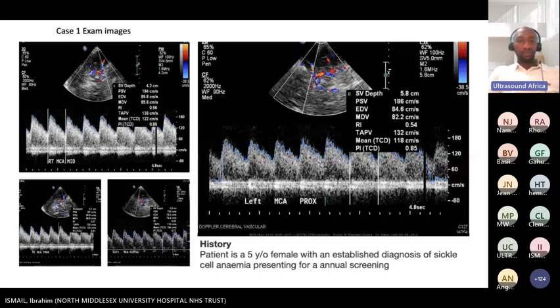Which one do you take? No, you use the highest average mean, the highest one. So you go for the worst case scenario. Yeah, you have to use the highest one. You don't average the average already. So you have to take the highest average that's coming out.